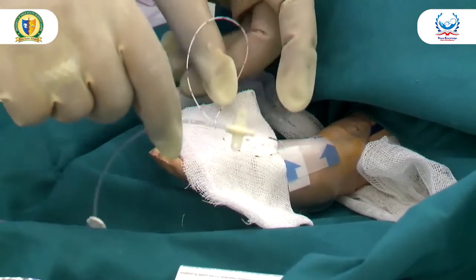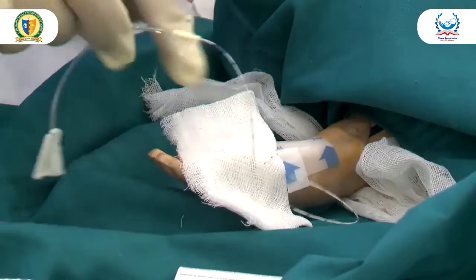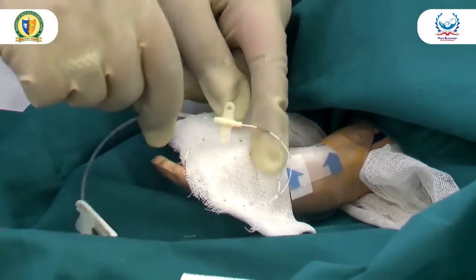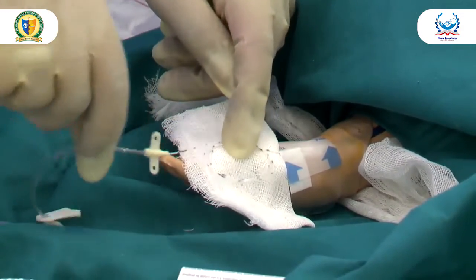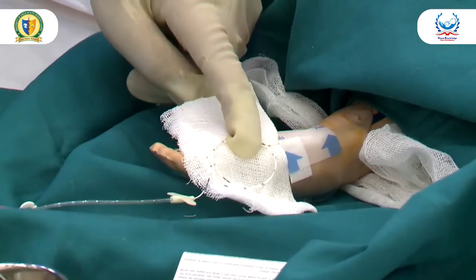हम pull कर सकते हैं, पर अगर हम push करेंगे तो infection जाएगा. नहीं तो pull क्यों कर रही हैं? 1 to 2 centimeter extra हम डालते हैं, फिर अपनी location. नहीं, अगर first करें, the line is on subclavian here. So what you will do? नहीं करनी पड़ेगी. कुछ नहीं करें.